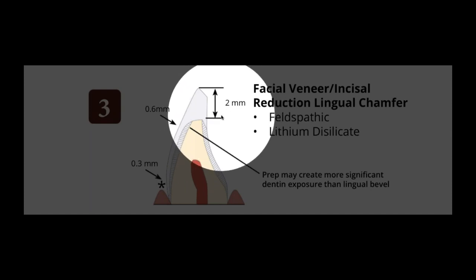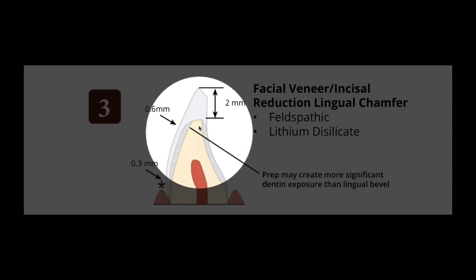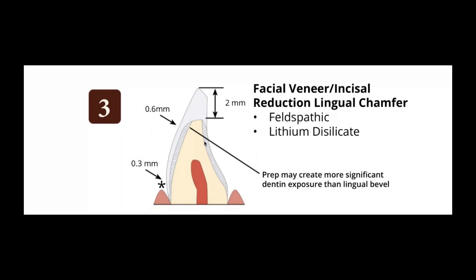The only time that this becomes a must for you is if there is some sort of decay that you have to manage, or some sort of chemical or functional wear that's been taken away and you want to replace some of the material. But otherwise, I would rather not have that wrap over. It makes it difficult to impression. It makes it difficult functionally, depending on where the envelope in the lower tooth is. And it also makes it more difficult for the restoration to seat properly because of that wrap around and those sharp edges sometimes. So I try to avoid this reduction anytime we can.